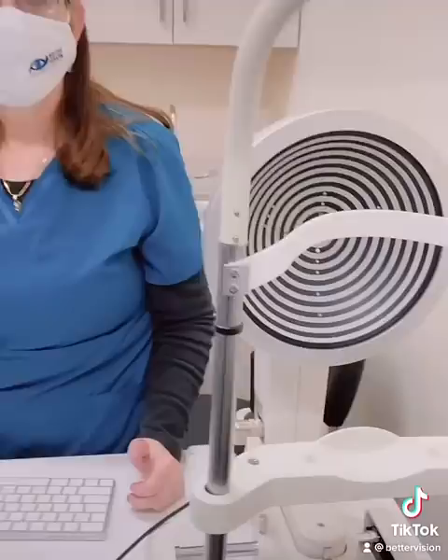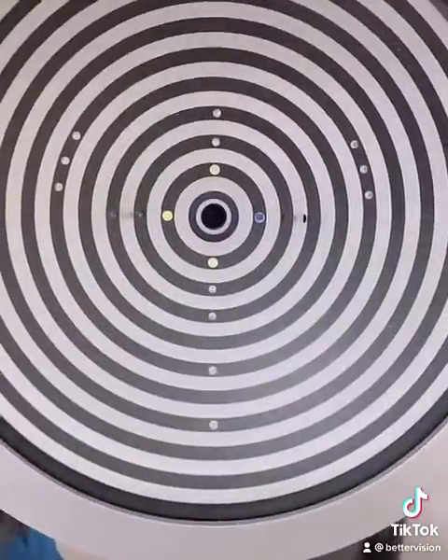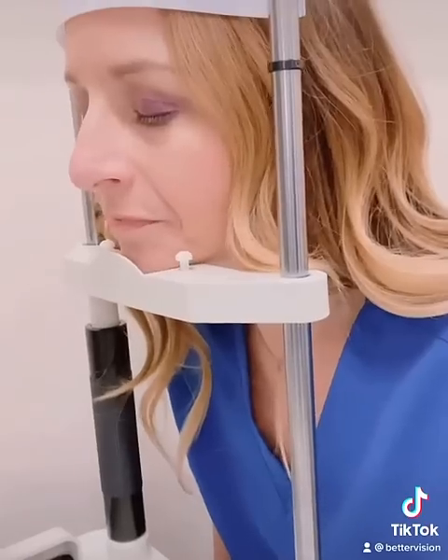This is a machine called Oculus, and this is a special machine that actually takes pictures of oil glands that are located in your upper and your lower eyelid.